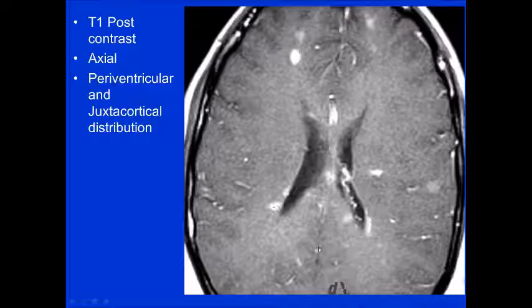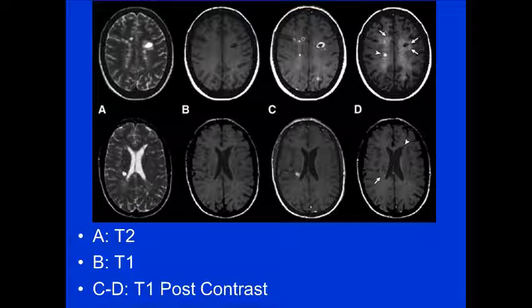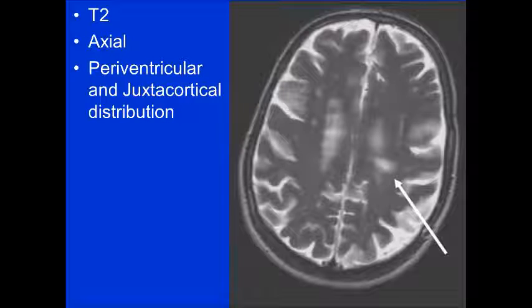On this case, image A is T2, B is T1, and C and D are post-contrast. On the D image in the upper right, in the left hemisphere, one lesion doesn't enhance — that's a remote lesion, a black hole. The other lesions are enhancing and represent active demyelination. Another axial T2 demonstrates lesions that are periventricular and juxtacortical.